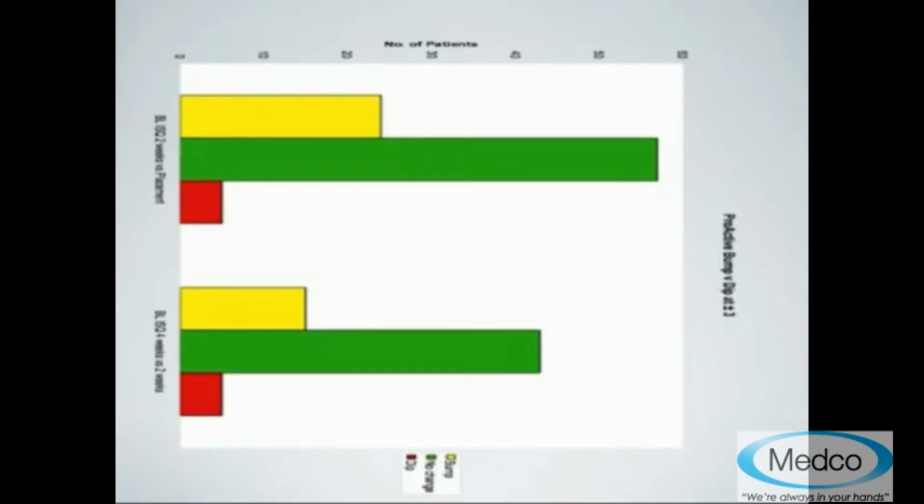The real limiting factor in implant dentistry today is not necessarily bone healing, but soft tissue healing more than anything. So RFA is giving us information that we never thought possible in the past, where we felt that we'd have to go through this dip period. Now we're seeing stability or bump period healing. And this may change the way we do implant dentistry in the near and distant future.